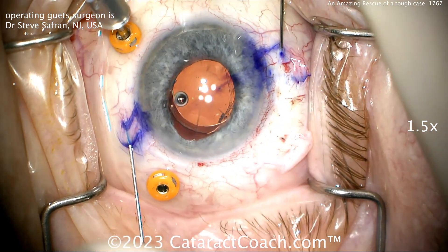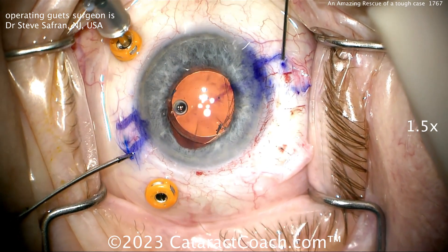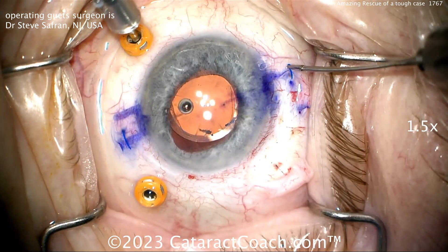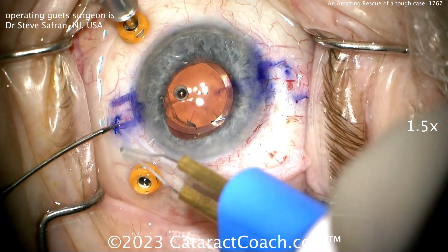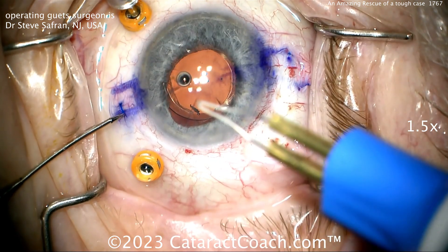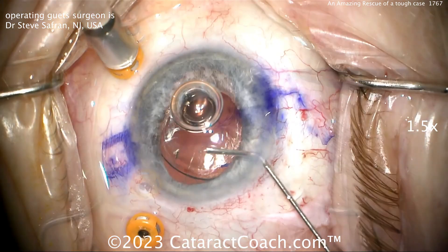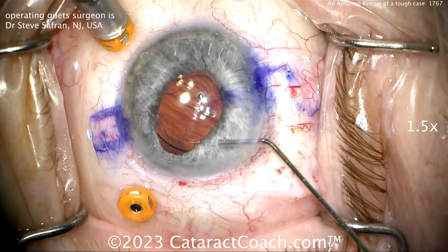Look at the cornea — you can see the 8-cut RK arcade that was done as well. Pulling that haptic through, holding on to that one, and pulling the other needle out — there you go, two haptics externalized. A little bit of cautery to create a flange. Remember, push that flange into the sclera — don't just leave it sitting as a nubbin under the conjunctiva where it's going to erode through. Once that's pushed in place, that looks pretty good. Good centration of the lens.